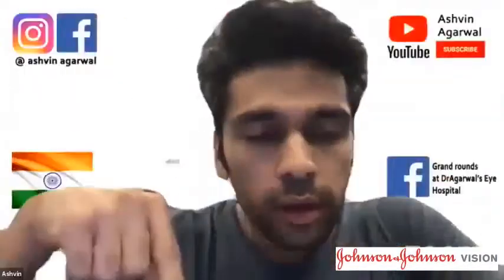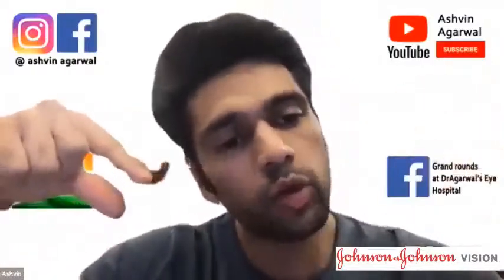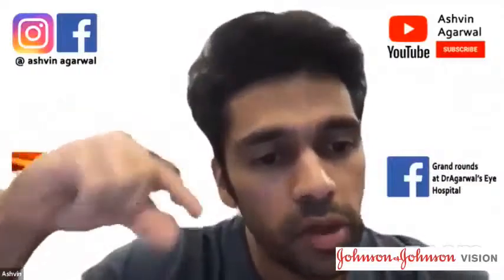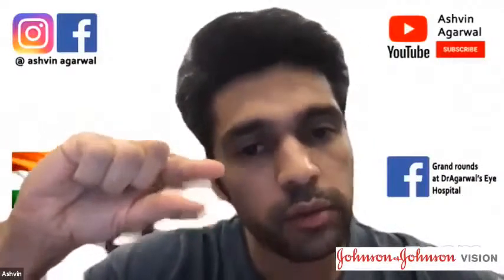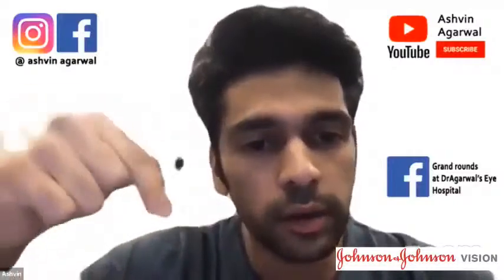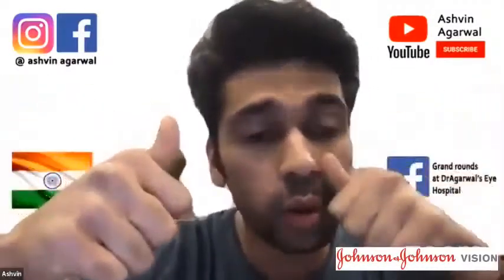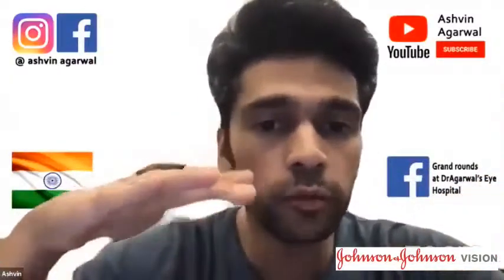The second thing with the tilt: if you go 0.75 on one side and 1 millimeter on the other side, you will have some amount of tilt. So try to measure yourself before you actually do this. Measure that distance from the blue limbus and ensure that you enter the scleral flap at the same point on both sides. That's the measure to remove the tilt. The second reason the tilt happens, as I said in my video, is because of the iris.